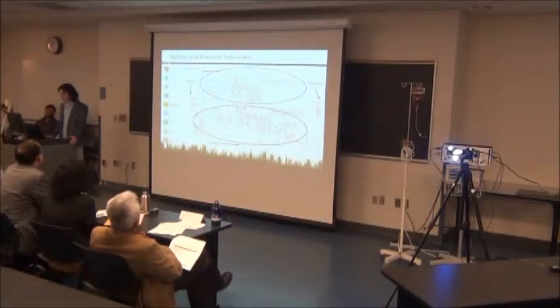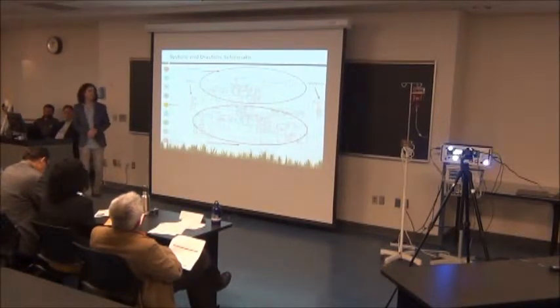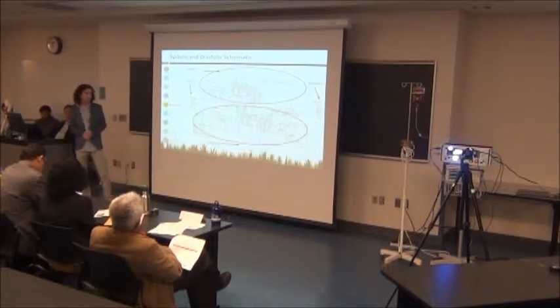Now, this is the schematic of the systolic and the diastolic, and the schematic is actually perfectly working. At the top is the systolic part, and the bottom is the diastolic part. The systolic part is a positive peak detector circuit. We use a 555 timer to control the 7476 JK flip-flops.